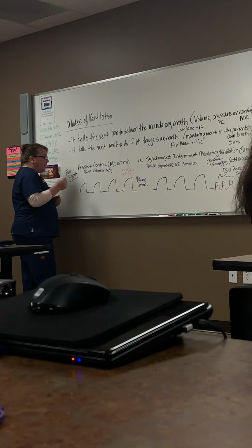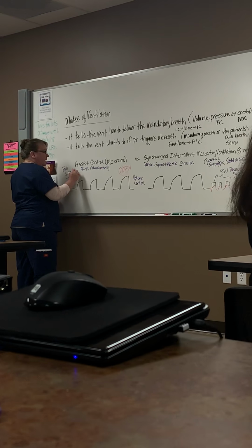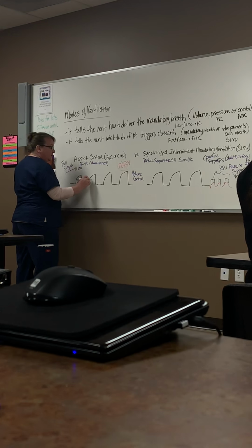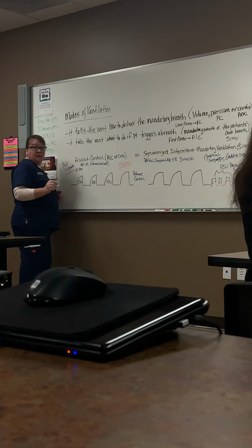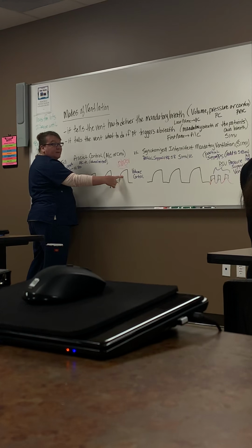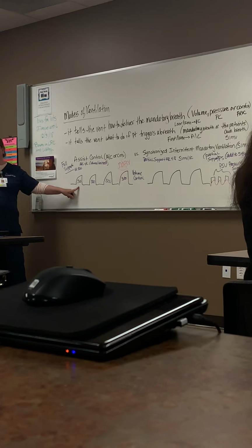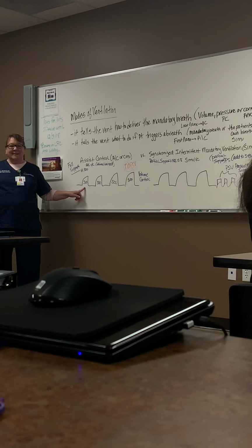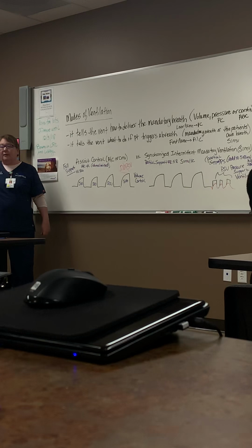So here, let's say that we have our tidal volume set at 500. So every breath is gonna be set to deliver 500. And if my patient triggers, what are they gonna get? 500, got it. Now, I put 500 on here, you guys, just for purposes of talking about it, but it's not gonna give exactly 500. It's always gonna be a little above or a little bit below.